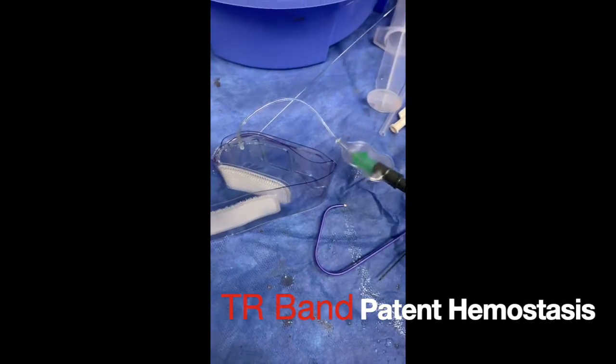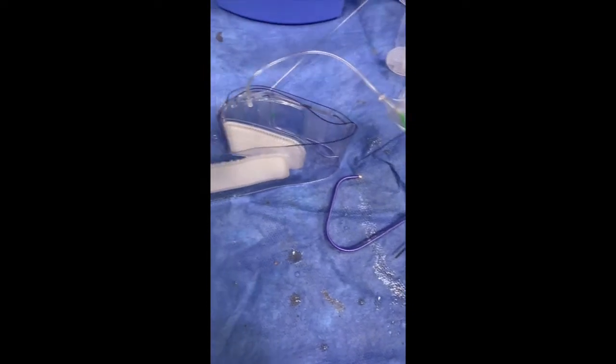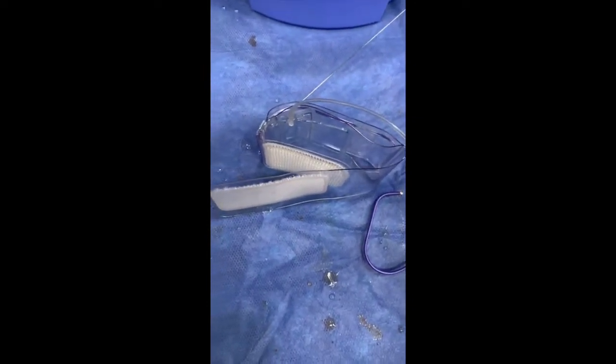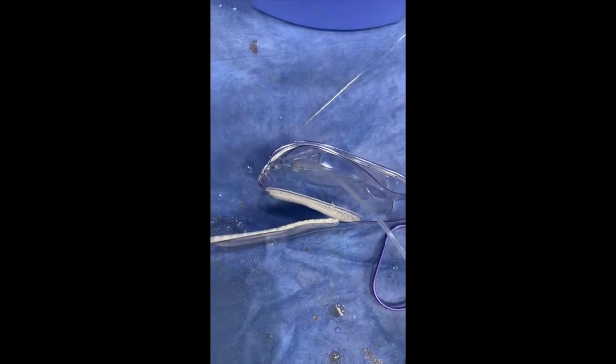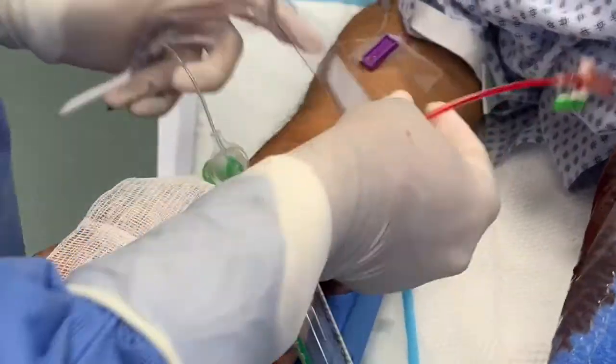This is Rob Adoran and this is TR band placement and patent hemostasis. Here is the TR band inflated before being placed on patients for demonstration. You can see there are two air cushions that are inflating to compress the radial artery.